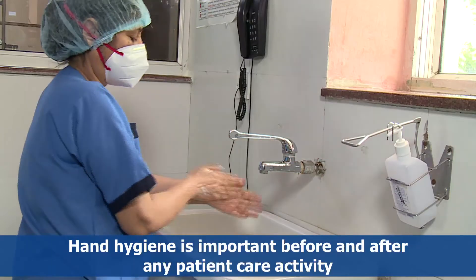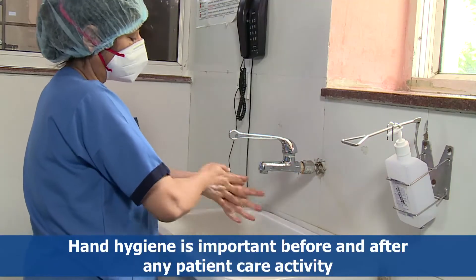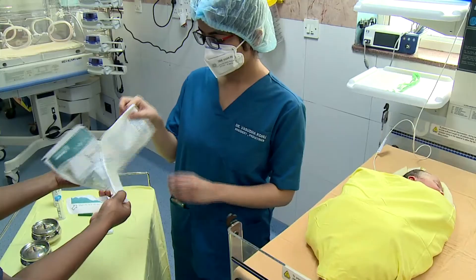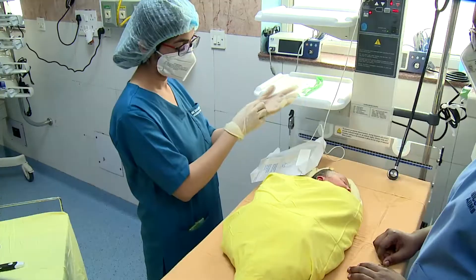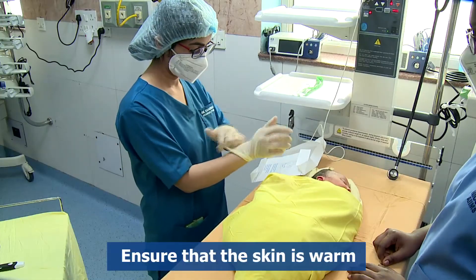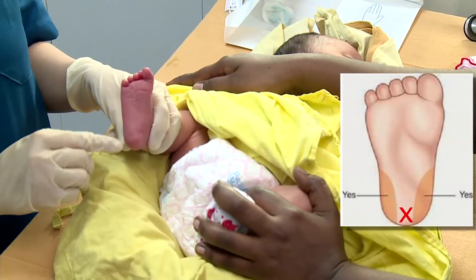Perform hand hygiene before the procedure. Bundle the infant to decrease pain and physiological compromise. Don sterile gloves. Choose the site for skin puncture.